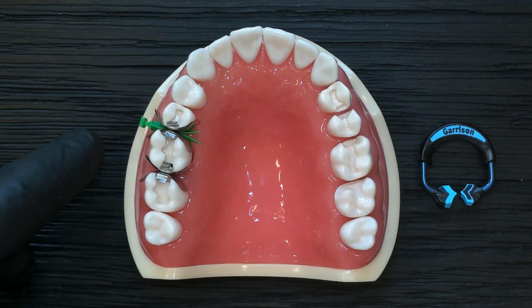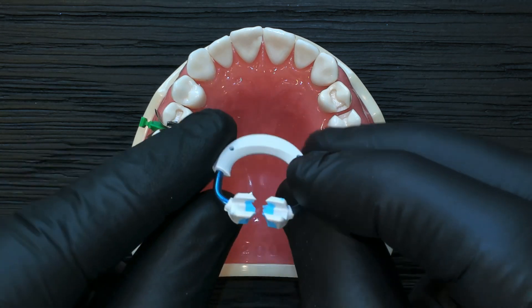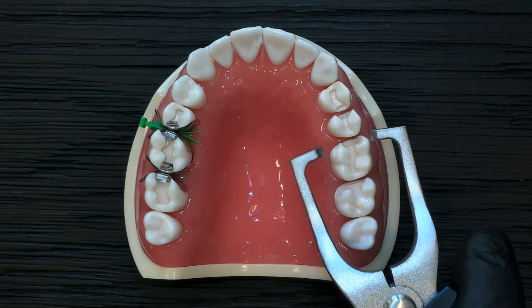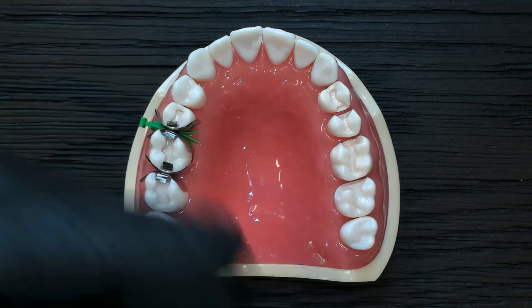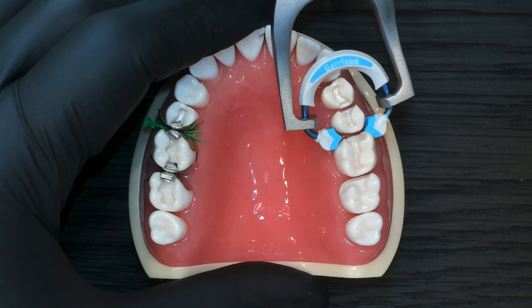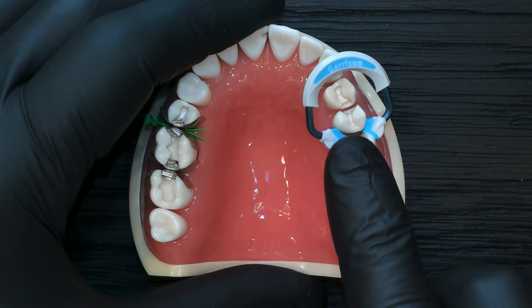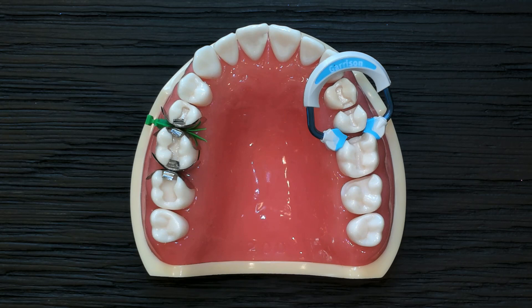The engineering that went into the quad system was specific to achieve exactly this. In traditional systems with universal pads, when you place these on, you're asking the ring to engage in two different embrasure space shapes and sizes. When you do that, you're losing ring force, and those hard ring pads or tines are going to be engaging with the teeth in different directions.